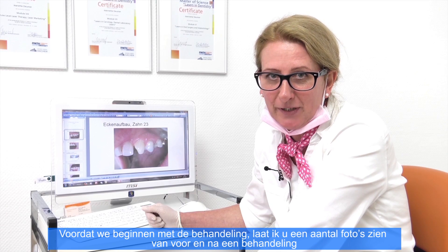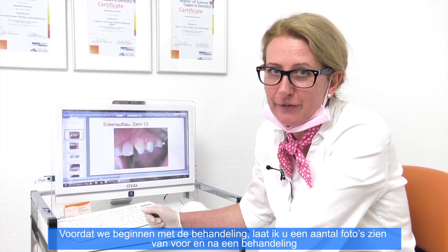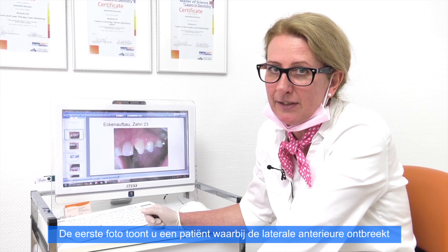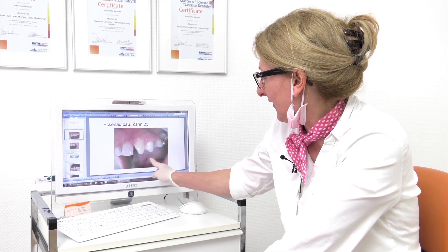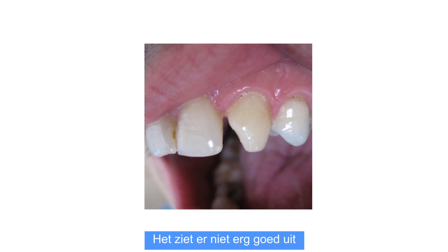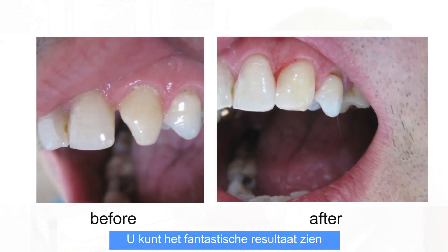Before we start with the treatment, we have a look at some pictures before and after the treatment. The first picture shows you a patient where the lateral incisor is missing and you can see it doesn't look very well, and after the laser preparation it looks like this — a fantastic result.